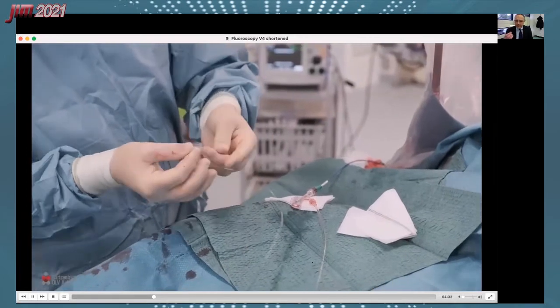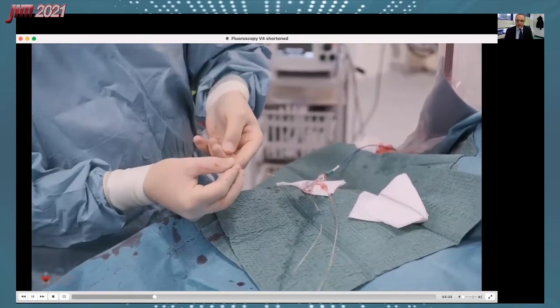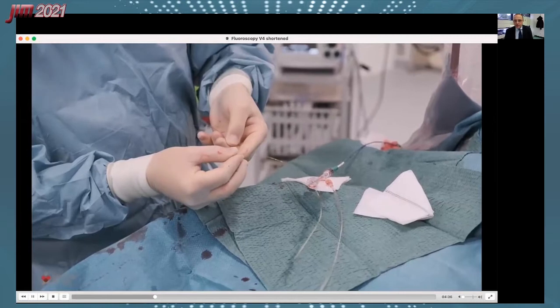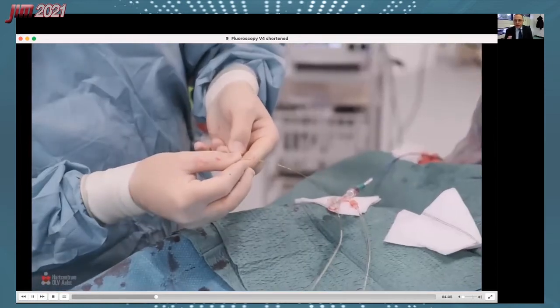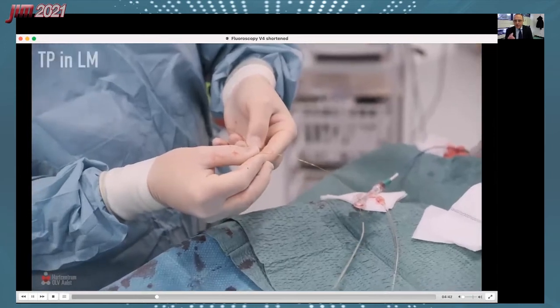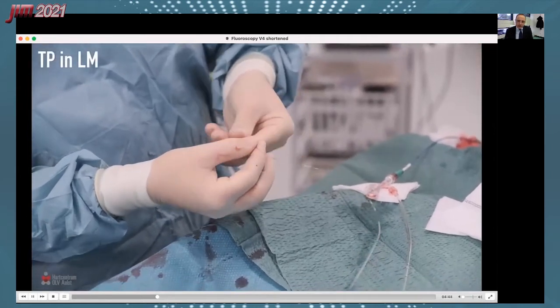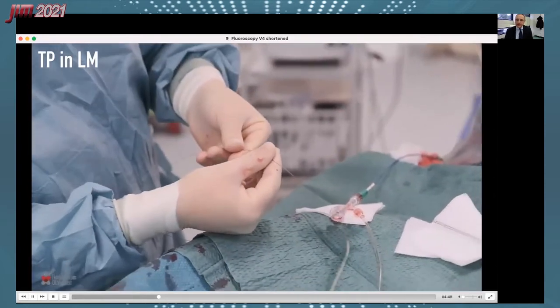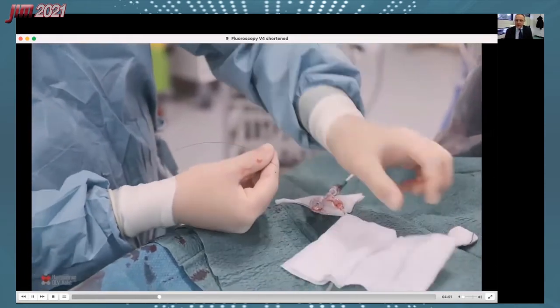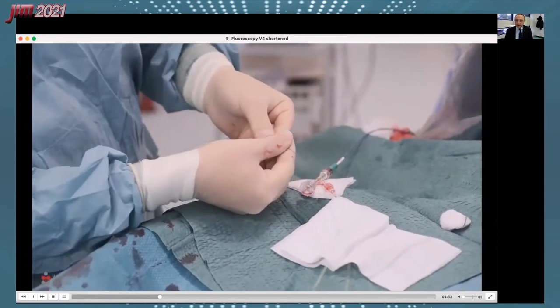You know, it's a very tiny microcatheter, as Luigi was alluding to before during the presentation. This is really a good profile. It's so thin that nearly mimics the tip of a guide wire. And that is why I suspect this microcatheter can really advance and slide everywhere without any kind of problems.